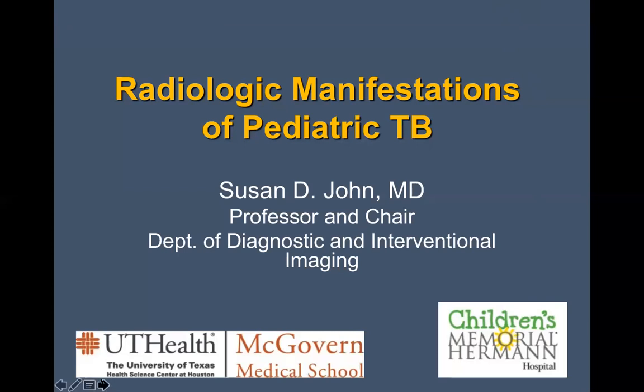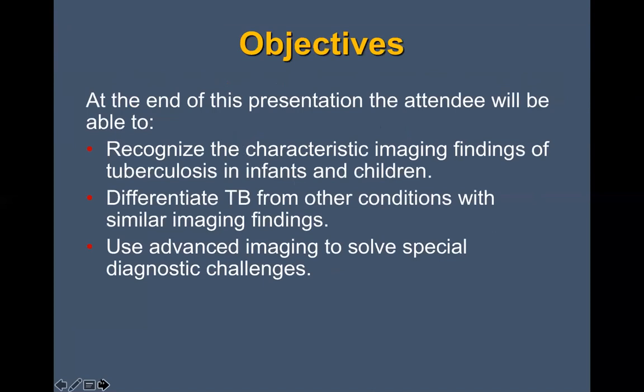And so we're going to talk today about some of the characteristic findings that we see on imaging, how we can distinguish TB in children from other conditions that might mimic it.